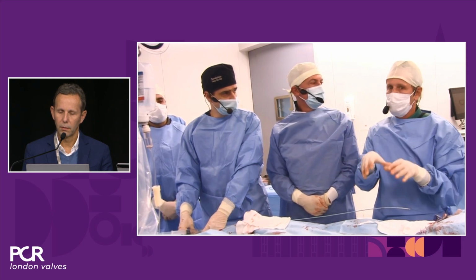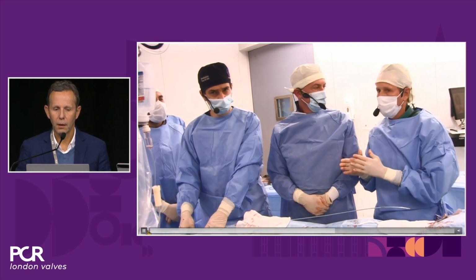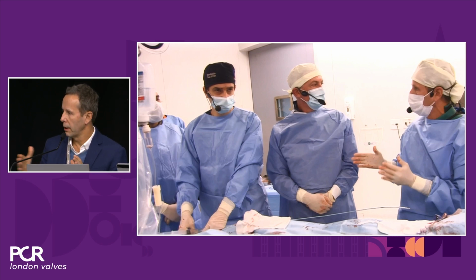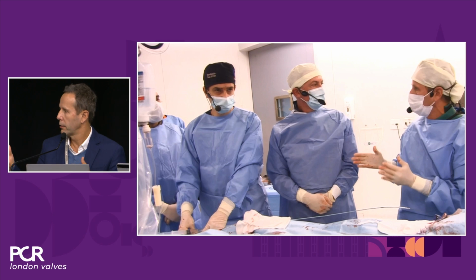That's why we choose the 26 valve here. And this is completely different than we are used to doing. So when we measure the size of the sinus of Valsalva and it falls in between two sizes, then we go to the measurement by TEE of the annulus or the non-contrast MRI, the whole heart MRI. But in the vast majority of cases, you can choose the size of the valve only based on non-contrast CT, and we don't need these extra modalities to define the size.